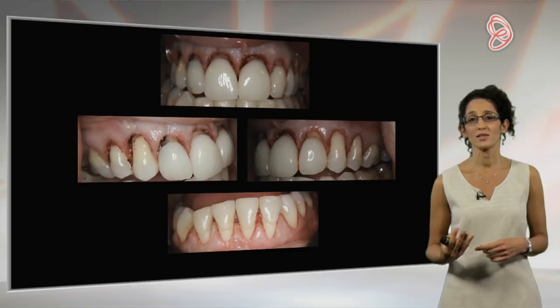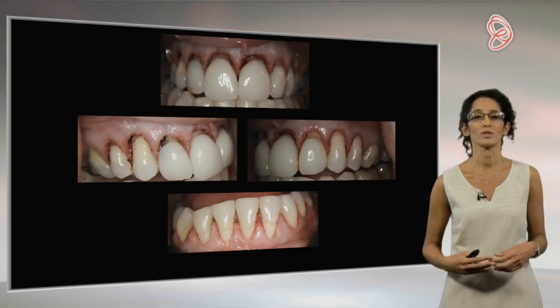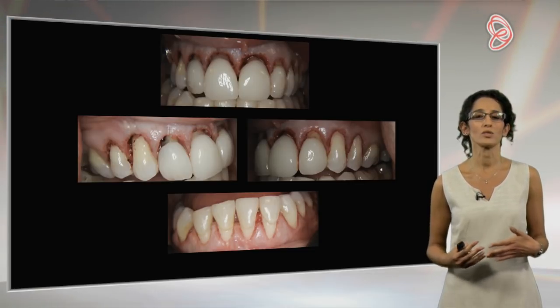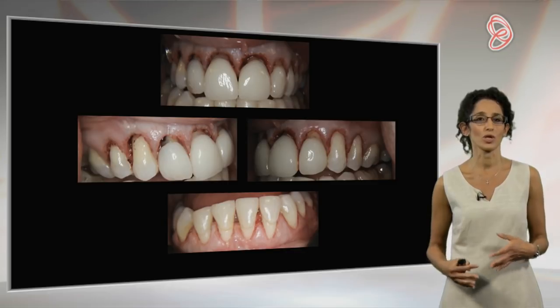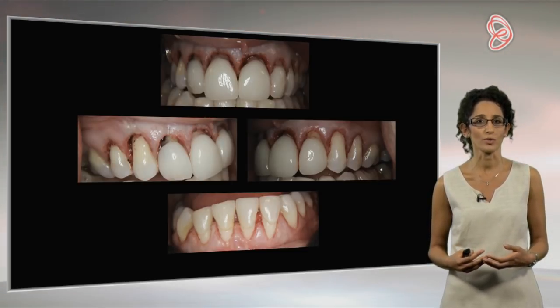But of course, remember with lasers, you get very little bleeding. So we will draw on the gingival margins, we'll sit the patient up, we'll take photographs, we'll keep changing their angle until we're all completely happy with the final shape before we end up cutting. And laser cutting is something that we call ablation.